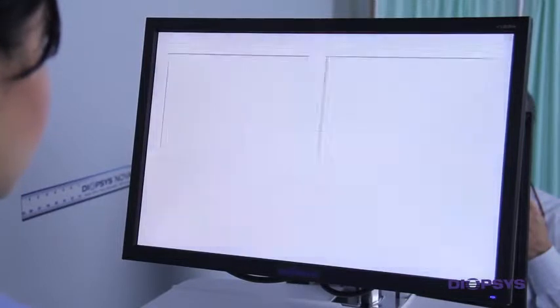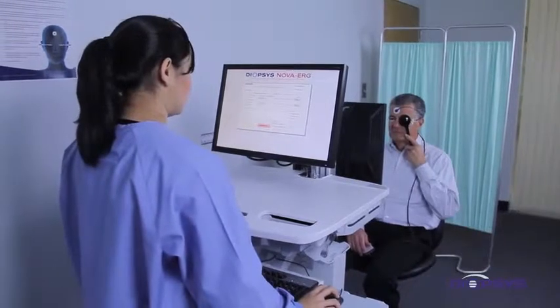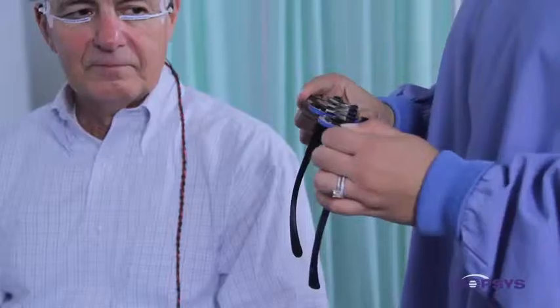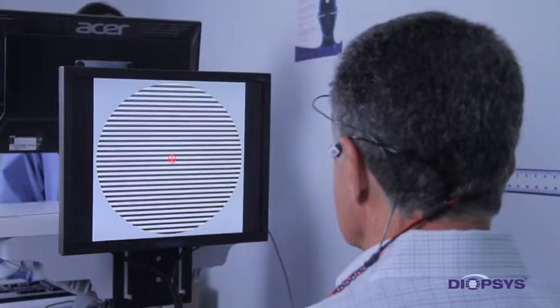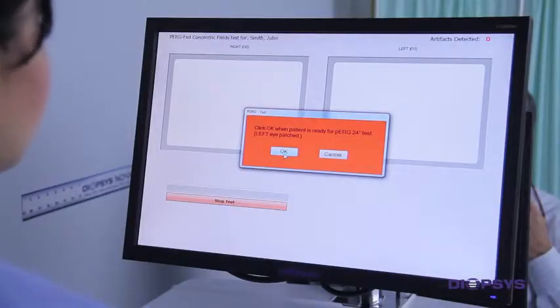Click on Run Test to begin. The first prompt will instruct you to patch the patient's left eye. The easiest way to do this is to have the patient use an occluder to cover the left eye. If the use of an occluder is not practical for a particular patient, then the patient's eye may be patched by the method normally used by the practice. If trial frames are being used, an occluding lens will also work. Once the patient's left eye is covered, let the patient know there will be a red circle surrounded by black and white bars. Instruct them to look towards the red circle while keeping the bars in focus and to blink naturally. Both eyes should remain open.